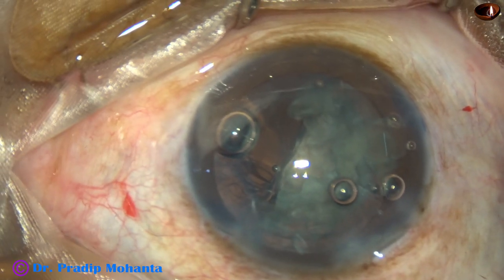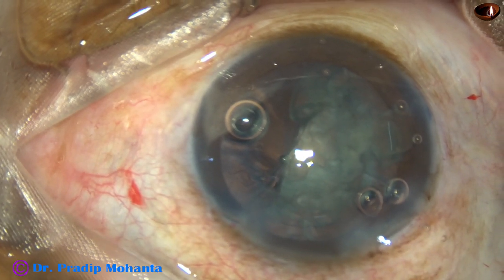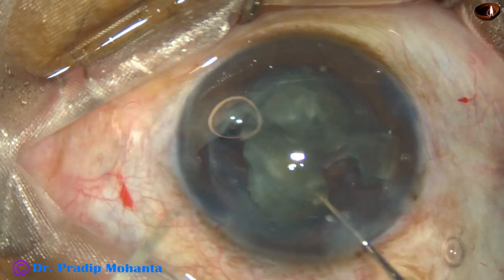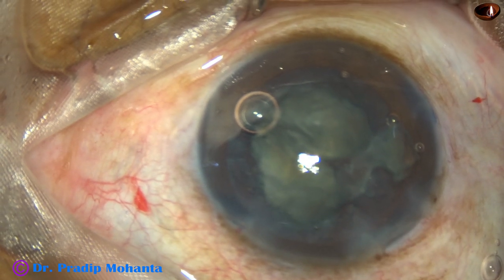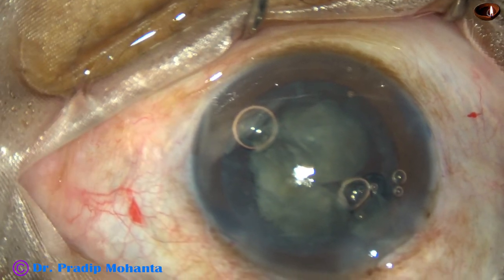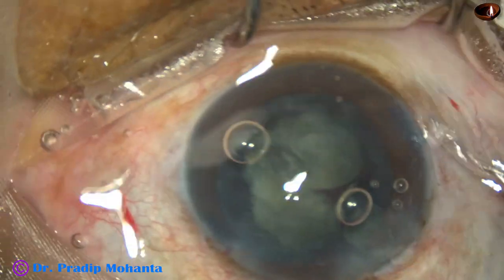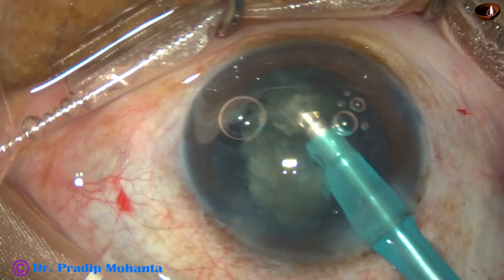I ask for Viscoat — from Alcon — and use it to nicely plug this opening. Viscoat can nicely plug small holes. Now I take hooks to mobilize the other hemi-nucleus and bring it out of the bag, divide it into two pieces, inject Viscoat again behind these two pieces, and decrease the bottle height.